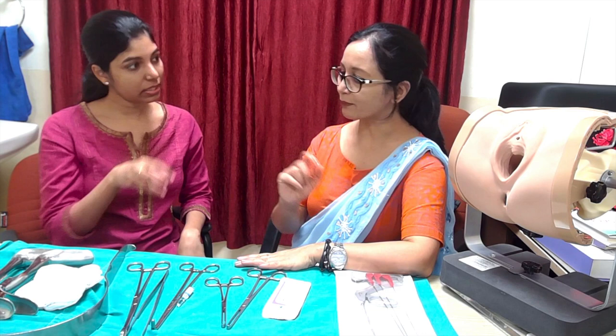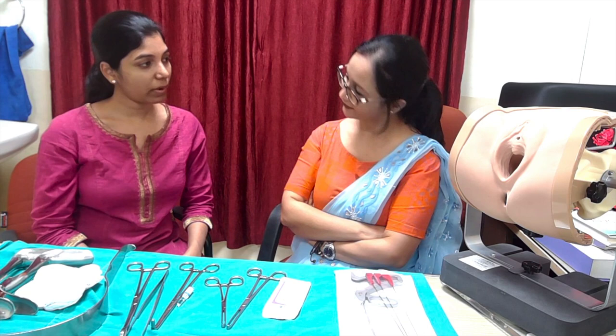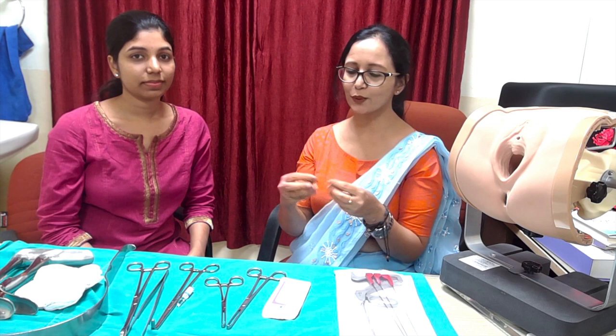For identification sutures we use 2-0 Vicryl — any Vicryl will do. You should not use silk or non-absorbable material because it will remain there. Since you are putting it inside the vagina, use absorbable suture material.